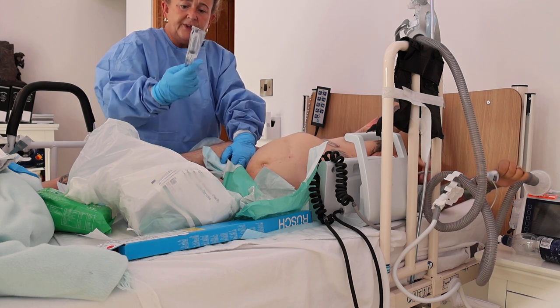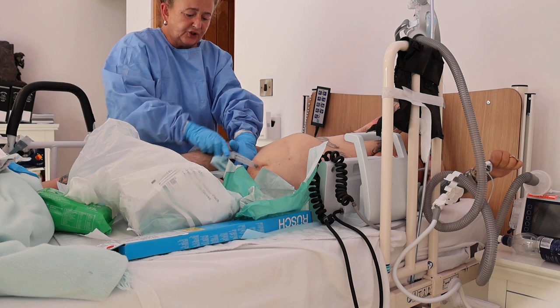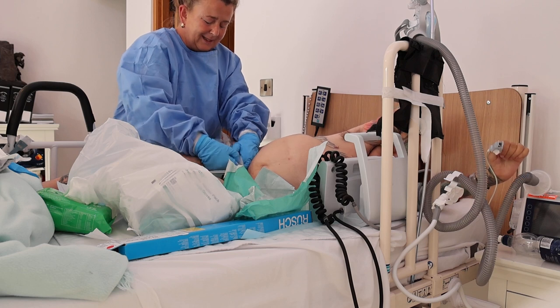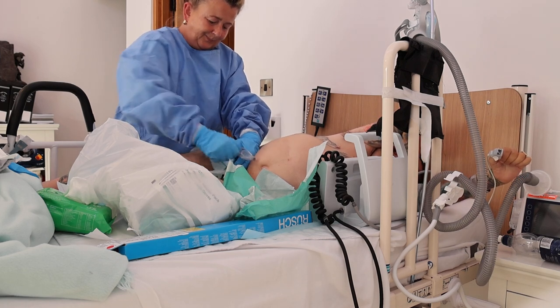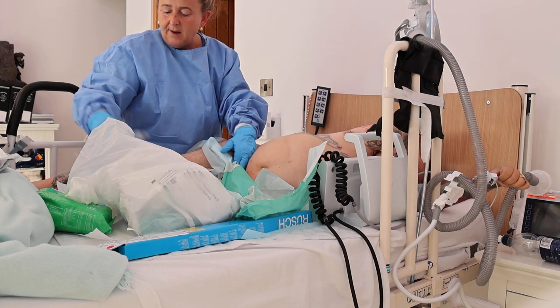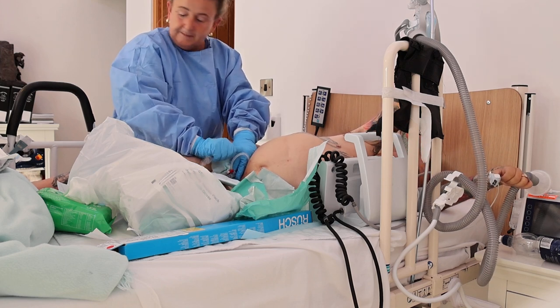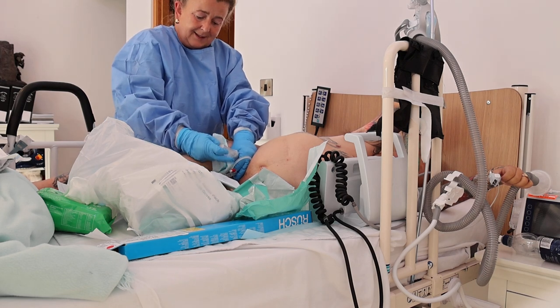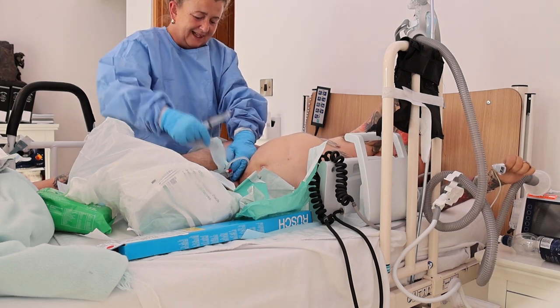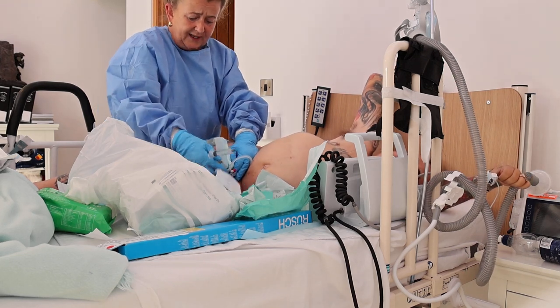So all these in the catheter packs, I always get them ready myself as well. I have double whammies, but today I'm just doing it as gentle as possible so I can show you how to do it, even though I need this glove off because it's too large. Here we go. I'm going to cause the trauma myself in a minute if I don't get this off. So what I'm going to do is hold it like this, turn it around so I've got double whammy on it. And when you're struggling to get these plastics off, always use... What are you actually doing? Well, I couldn't find the seal because I haven't got my glasses on, but it's all going in the bag.